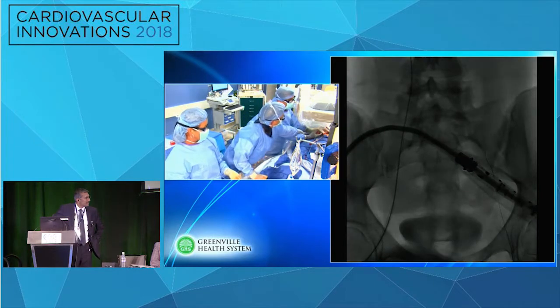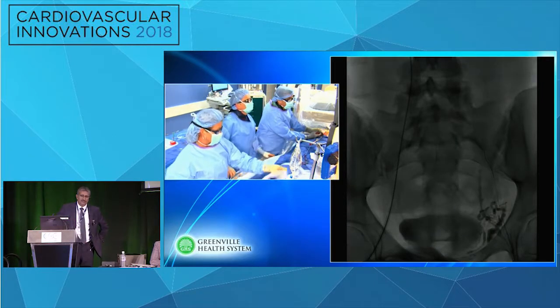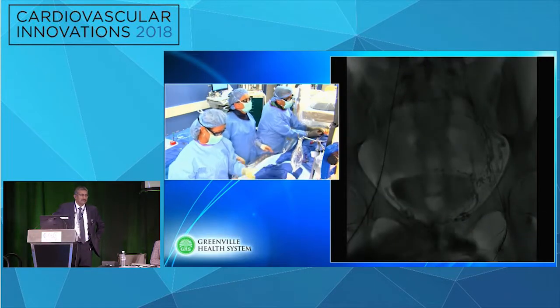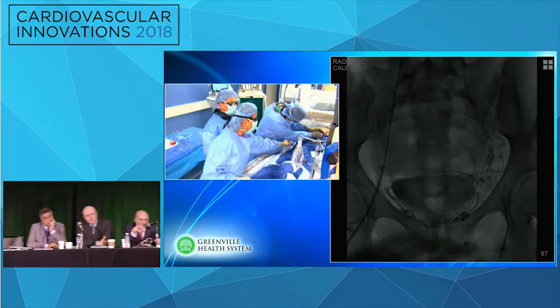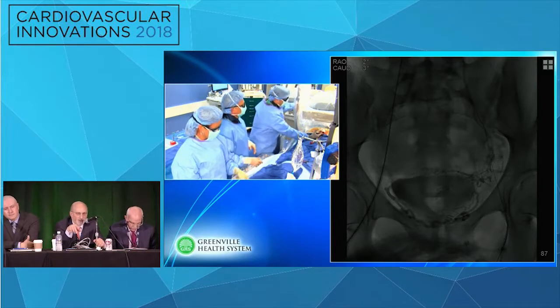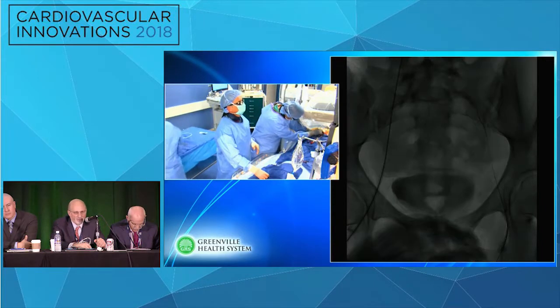Kenny, I agree. A SIM2 is a really great catheter once you get into the little nubbin, if you will. But the key here is to try to find that nubbin. You actually have your previous angiogram, which you just showed. Their completion angiogram shows you exactly where the vein does enter the IVC. My experience has been that using something like a coronary guiding catheter to put you up against it and then beat away a little bit, you might be able to recreate the channel where it exists.